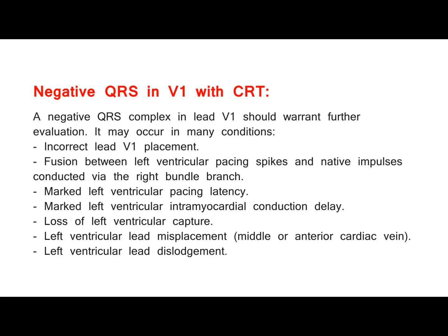Negative QRS in V1 with CRT. A negative QRS complex in lead V1 should warrant further evaluation. It may occur in many conditions. Incorrect lead V1 placement. Fusion between left ventricular pacing spikes and native impulses conducted via the right bundle branch.